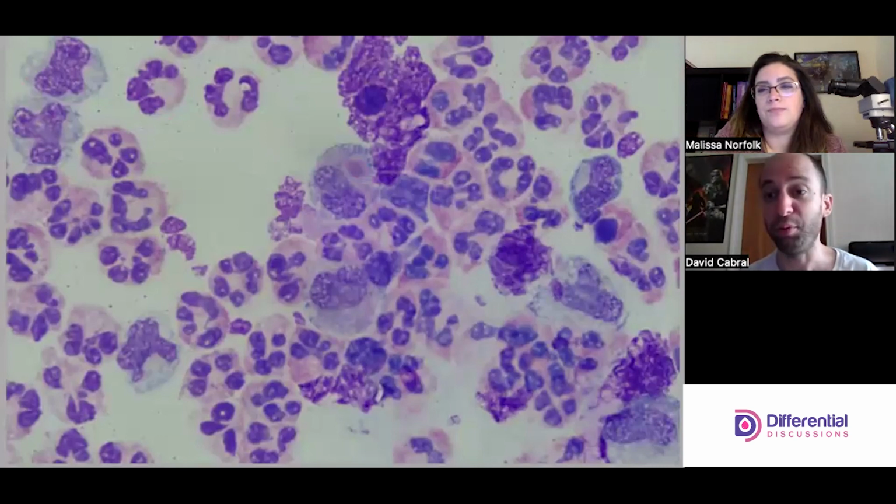And then with joint fluids, I'm not a microbiologist, but I do my very best, and we're trying to look for possible bacterial organisms or anything. At the moment, I don't see anything, but we'll be careful and look for that as we go.